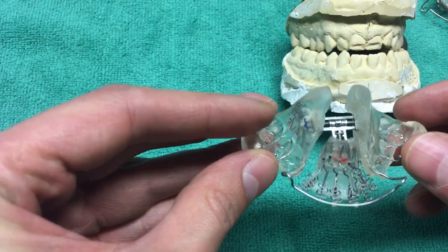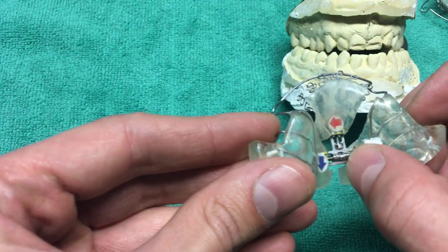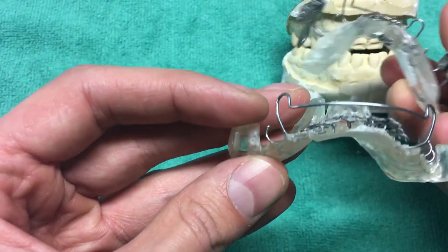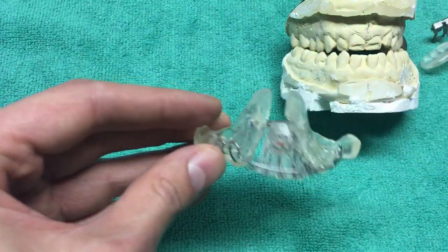The second portion of this — not only the springs but also these screws here — widens everything out, and that's on both the upper and lower. They have adjustments, and it's a quarter turn every four days, as long as you keep the appliance in for the right amount of time.